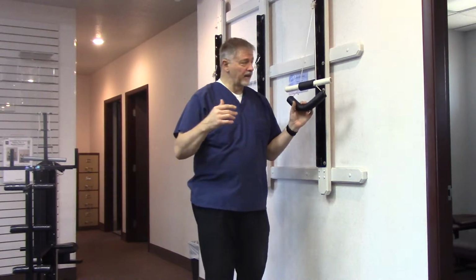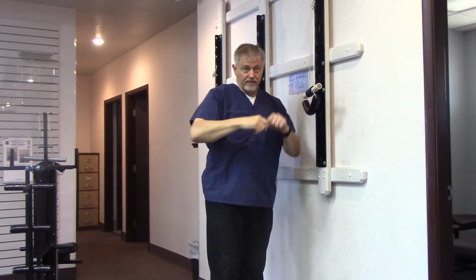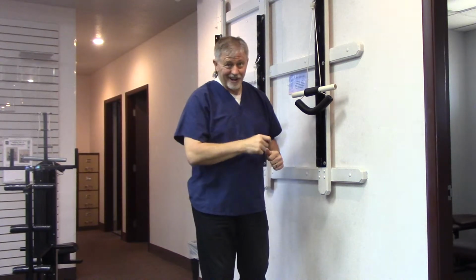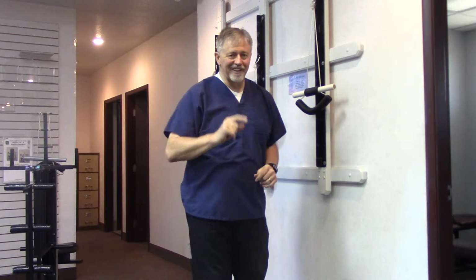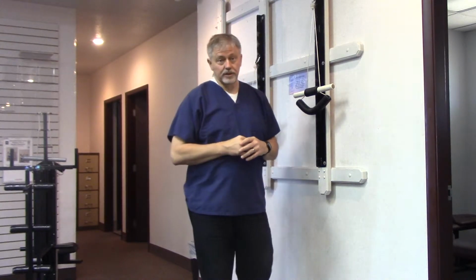If it's way too long, we're going to take and tie a rope. If you don't know how to do that, get one of your local Boy Scouts. He'll tie a knot for you. He'll be happy to do that. If it's too short, we're going to have to put extenders, which is basically a piece of rope that is tied into a loop, and then we lace the loop, and we'll actually do a video on how to do that so that we can extend it. And we can put multiple extenders depending upon what is the need.